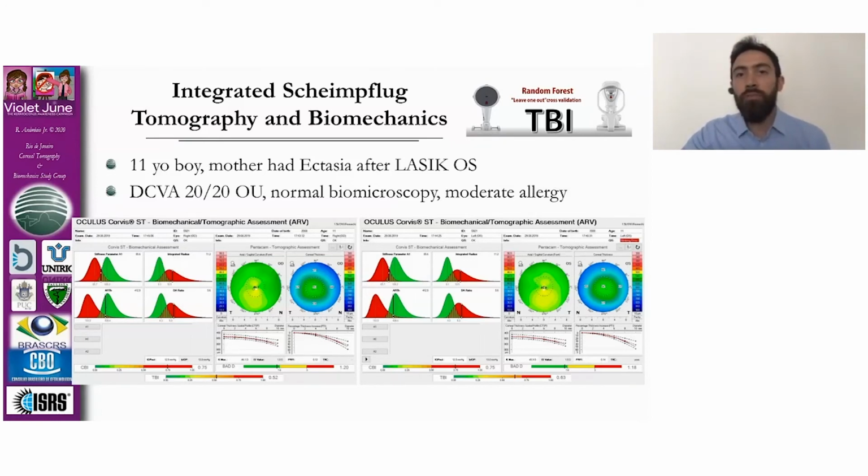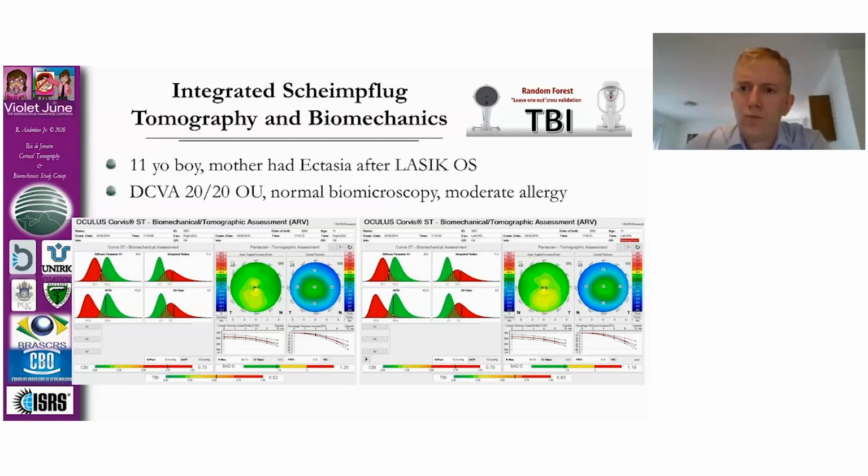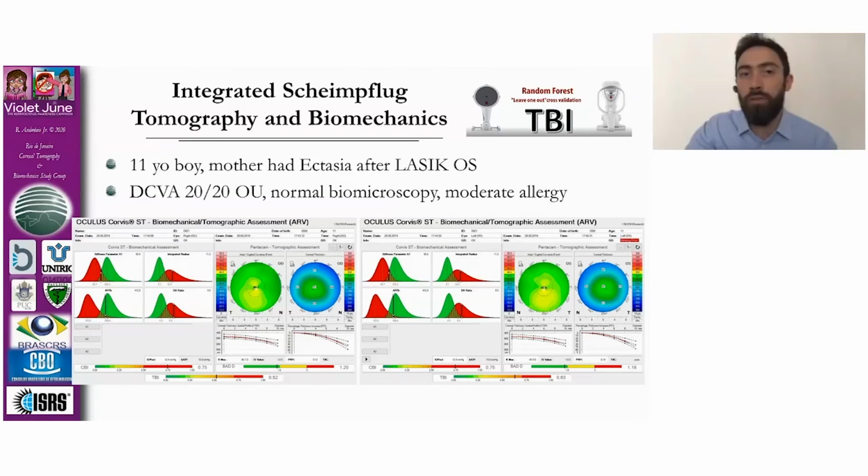So I think that if you have a patient that is clearly abnormal with one of the two, what we should do is at least wait for a good period of time, and not say, well, the CBI is abnormal, but the TBI is 0.35, I treat. I think that we should really be careful because these are healthy patients. We are not treating keratoconus. These are healthy.